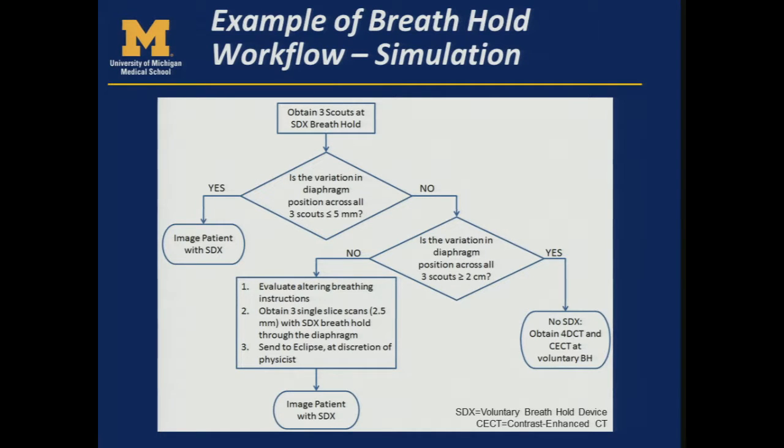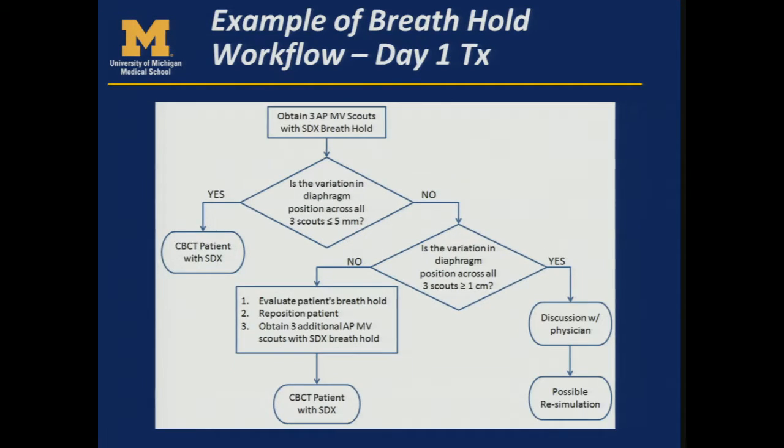This is something that Christy Brock put together. And so what we do for our breath hold simulation is we'll acquire 3 scans to look at the reproducibility of a breath hold. And if a patient isn't able to have a reproducible breath hold for treatment planning, we may decide to treat them free breathing, or we may decide to employ some additional breathing instructions for that patient. And then, of course, we do a very similar process on the first day of treatment.